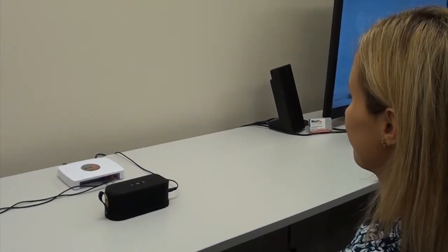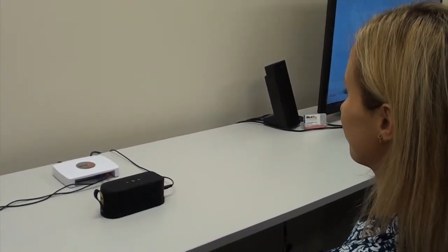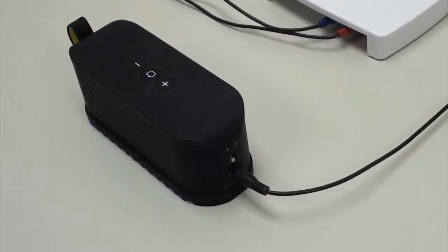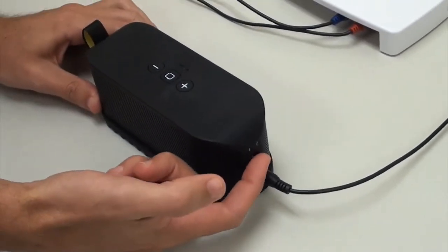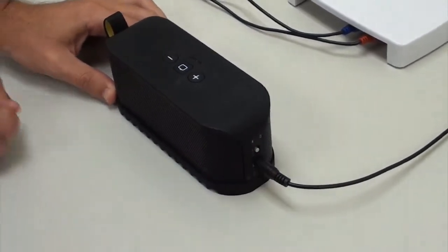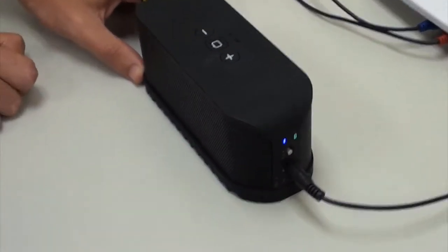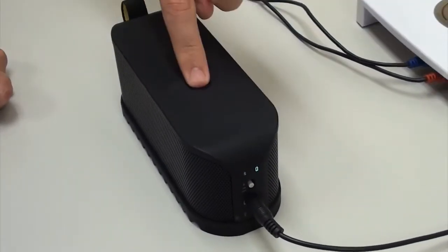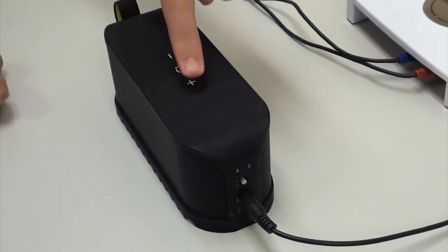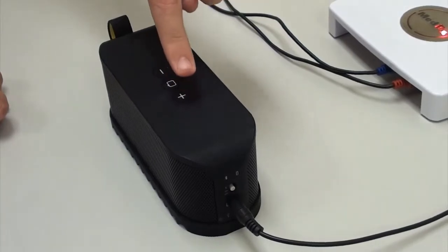You're going to have the patient come into the room. They're going to sit down in the chair in front of the speaker. The speaker that I'm using today is the Jabra portable speaker that is an option for you. You want to make sure you turn that speaker on and press the plus button repeatedly until it beeps at you.